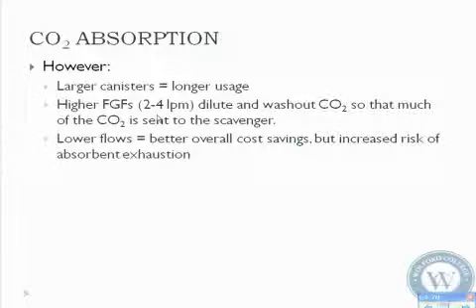Only one of them, not dual, but with the newer system, you can push a button, disconnect it during anesthesia, and it sends everything to the scavenger. Get a new one, plug it back up, and you're good to go. But the machines that most people use around the country are not the brand new ones because they're really expensive, and all of our older machines work perfectly. With these, if you start seeing rebreathing of CO2 and you figure out your CO2 granules are exhausted and full of CO2, you cannot change it during the case. If you drop that CO2 canister, you lose all volume in your circuit, because it is part of the pressurized system. But the larger canisters you can use much longer because they have a lot more granules in them.